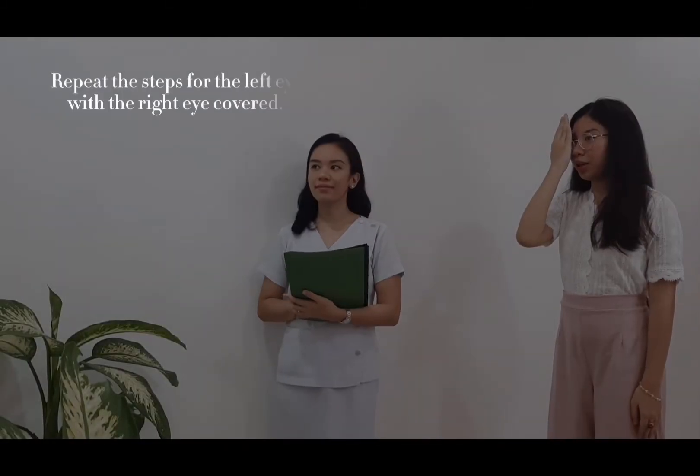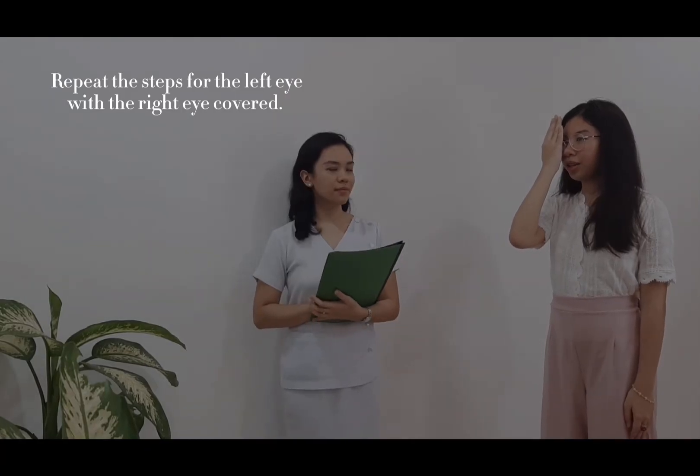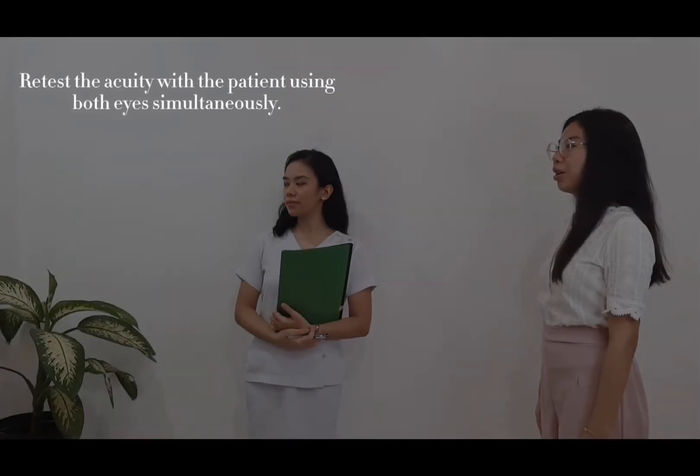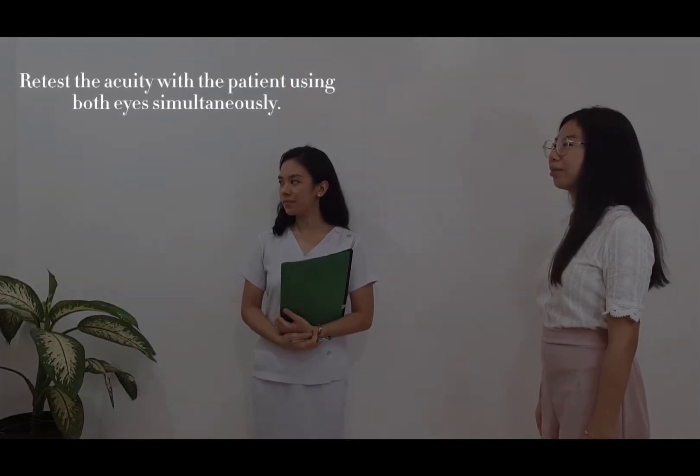Now can you please occlude your right eye and read the letters again. Repeat the steps for the left eye with the right eye covered. Now can you read the letters without covering either eye? Retest the acuity with the patient using both eyes simultaneously.